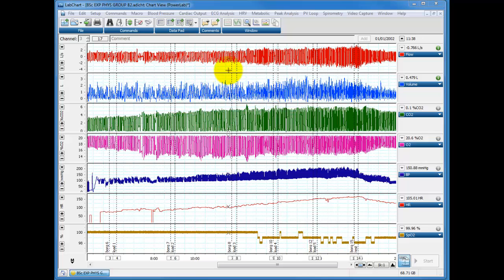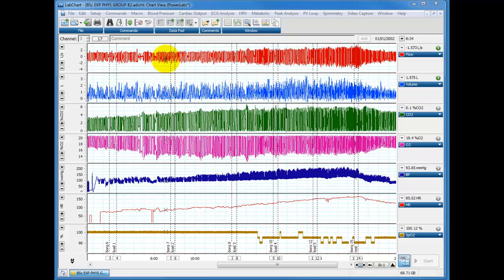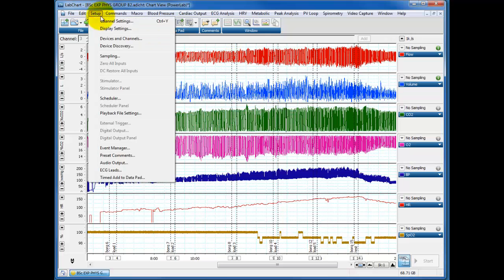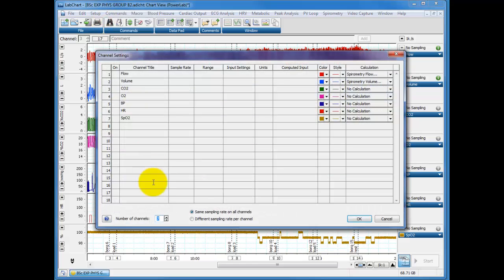But we're only interested in the flow. We're not going to bother zooming in or zooming out, we just want to add a channel to measure the flow rate, in other words the breathing rate. So we go to setup, choose channel settings and we add another channel. I've got seven but you may only have two or three but we'll add another one.